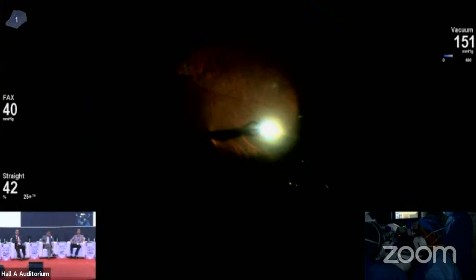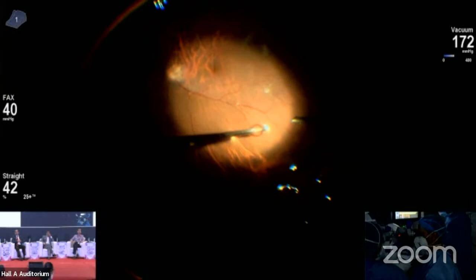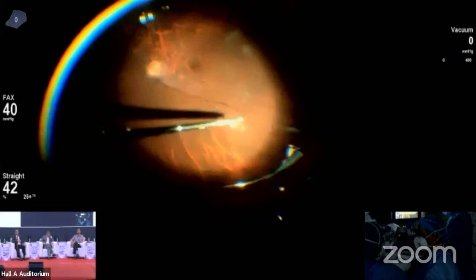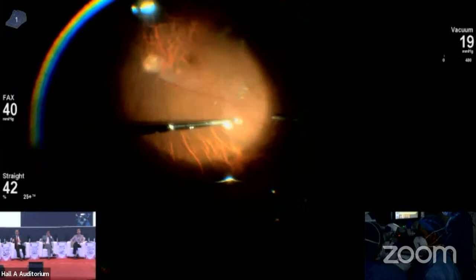So once you go on to air fluid exchange, at times the visualization may be a problem because there are reflexes, lots of them, because of the air. But you just have to be patient. Once most of the vitreous cavity is occupied by air, these reflexes tend to go away.